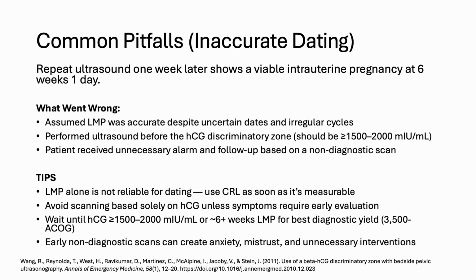And then waiting, it might be advisable, unless there are complications going on, to wait until the HCG is above that 1,500 or 2,000, and in some cases up until 3,500 based on ACOG, just being extra conservative. Early non-diagnostic scans can create anxiety, mistrust, and unnecessary interventions if they're not needed.